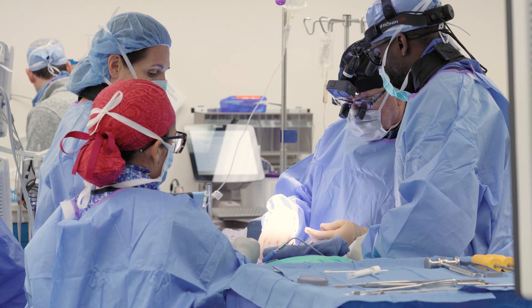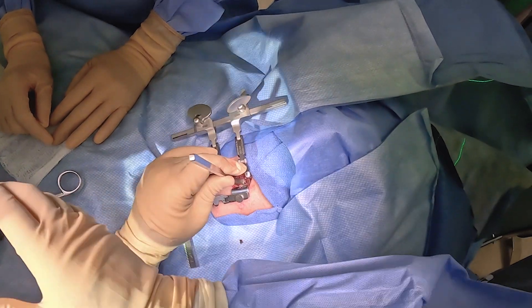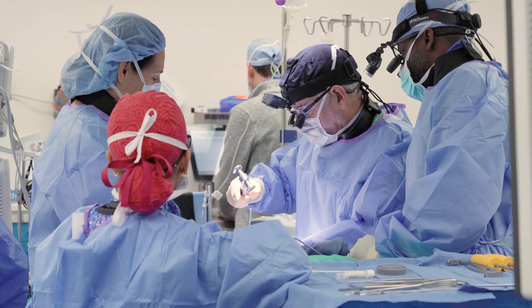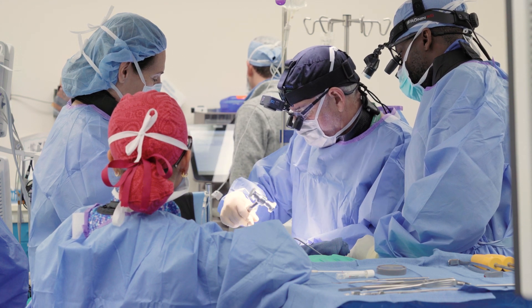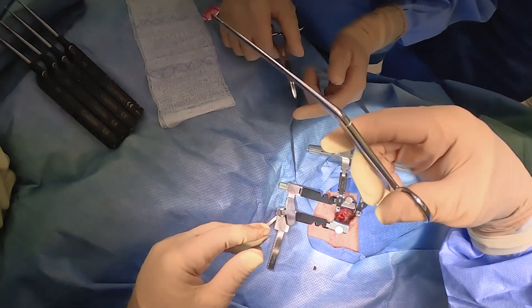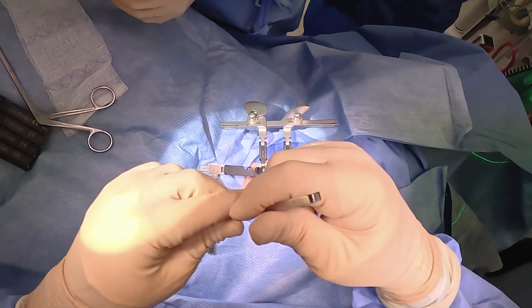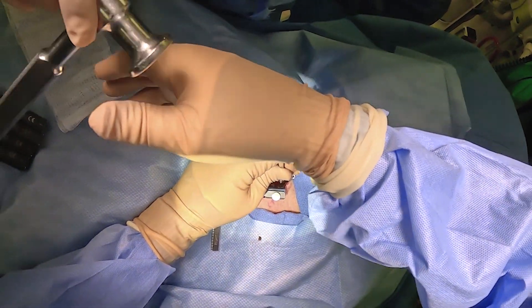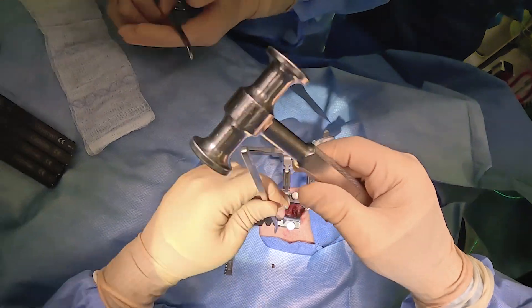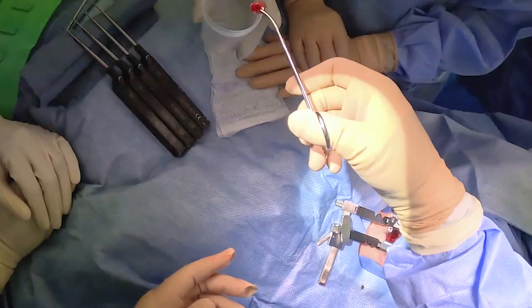Here we're taking out some fibrous tissue; we'll send it to pathology to examine it. And this is the maneuver to get the old end plate off — this just allows it to be gently pushed towards the middle of the space, and there it comes out pretty easily. We'll repeat that for the upper end plate. Just a little tap, and that's all it really takes to loosen it. And there's the old end plate — so now we've got the empty disk space.